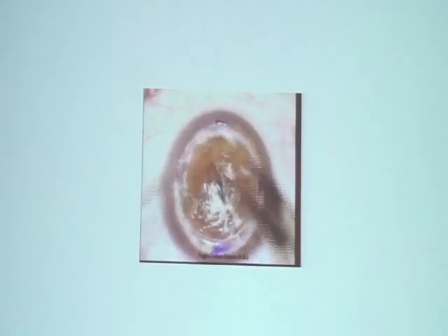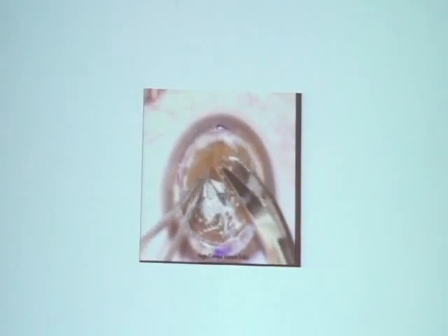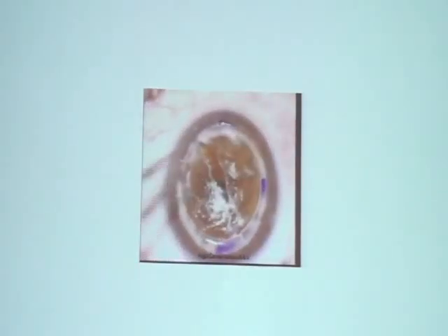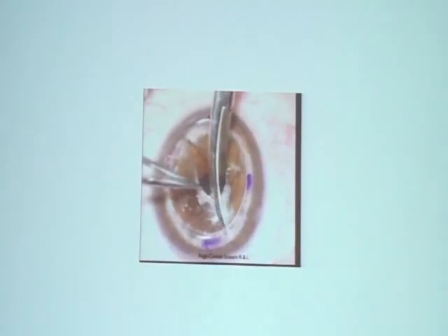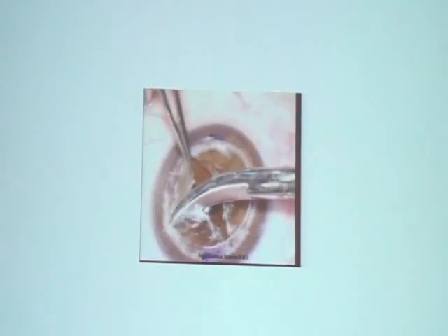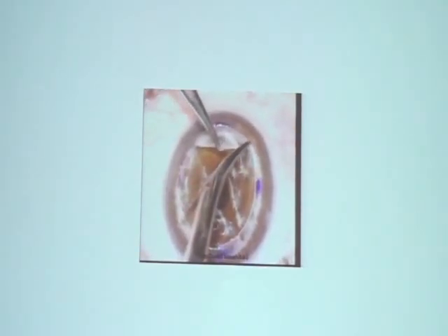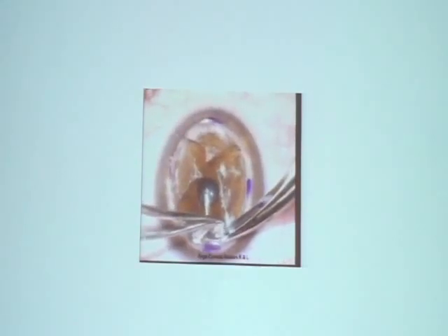And some people at this point of time put in cohesive viscoelastic to push the Descemet back and then remove the residual stroma. But once you put viscoelastic, you cannot really see the Descemet membrane, and sometimes that can be counterproductive because once your opening is enlarged, all the viscoelastic comes out, and if you cannot see your Descemet, sometimes you may end up traumatizing it.